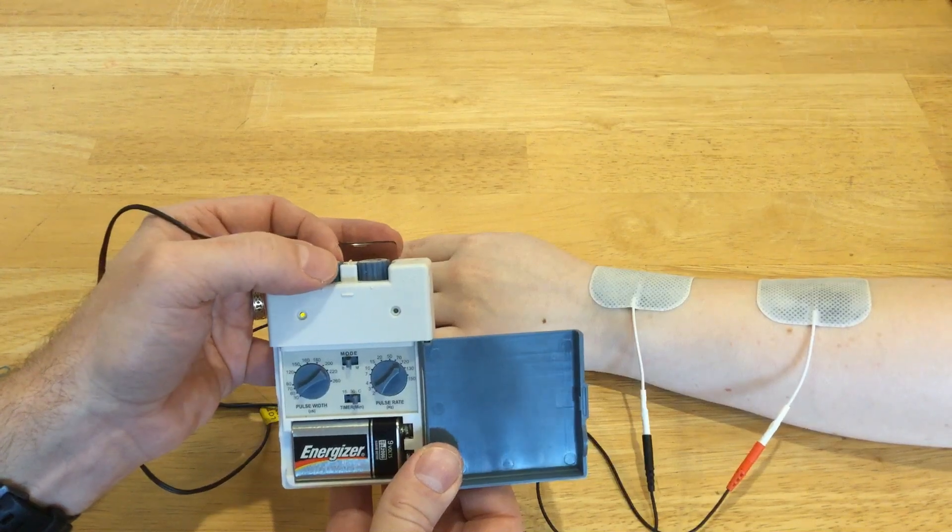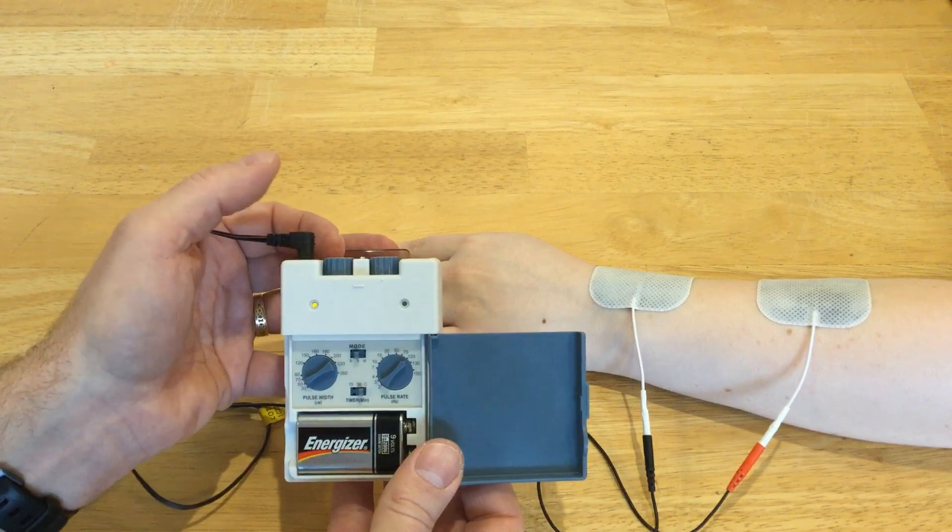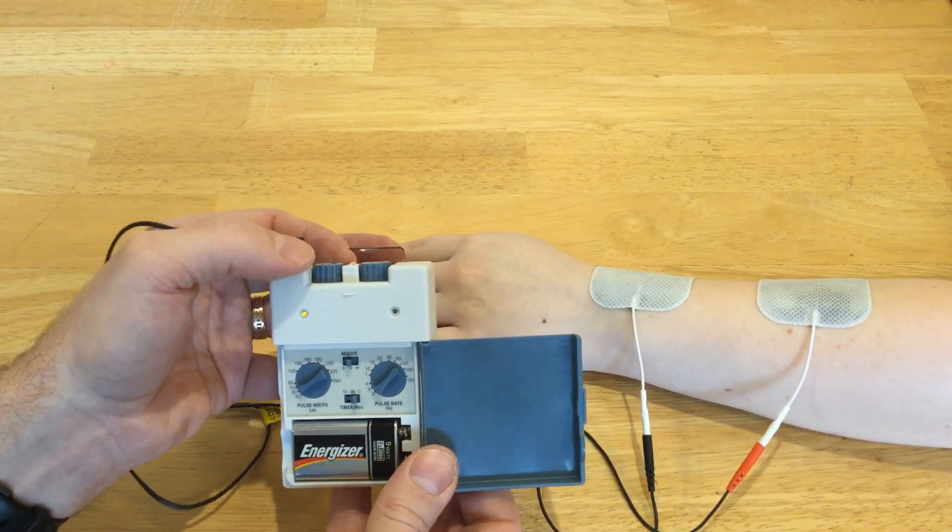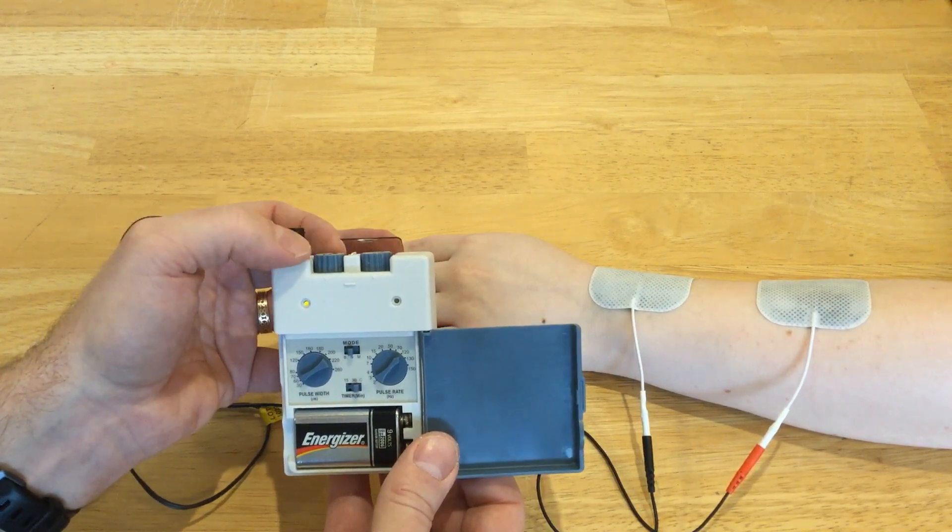Okay. And what does it feel like? It's tingling. Okay, so she has a tingling sensation. And is it really intense or kind of mild? Mild. All right, and so she has a mild tingling sensation.